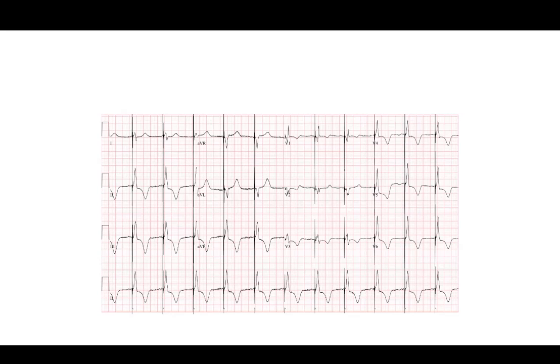So I think this is almost proof that you're capturing 2 different tissues. It's like having 2 thresholds, except it's unipolar and bipolar. Yeah, I guess the anode was in the septum, right? Yes. I've been programming most of the last cases also on unipolar, but sometimes you finish the case, you tested it, everything's good. You connect the generator because the generator's in bipolar, and then you see, what was this? It looks different right away, and it's the anodal stimulation. But the total QRS duration is almost the same in most of the cases. It's just the beginning of the activation that looks different with the anodal stimulation.